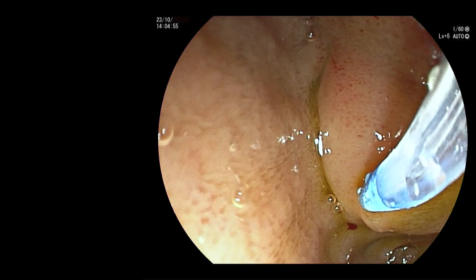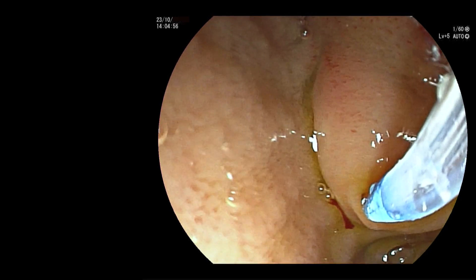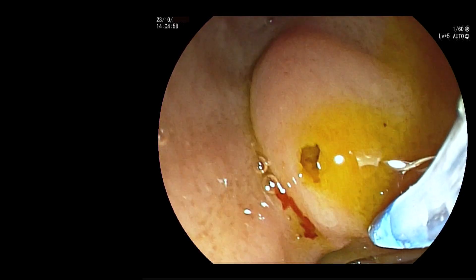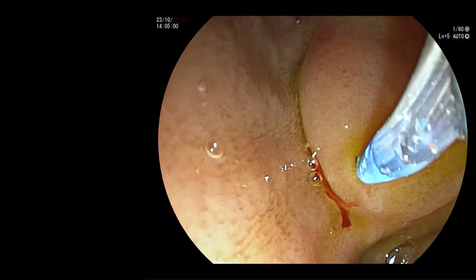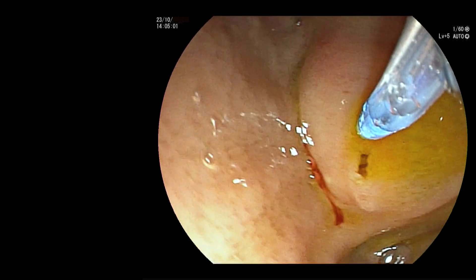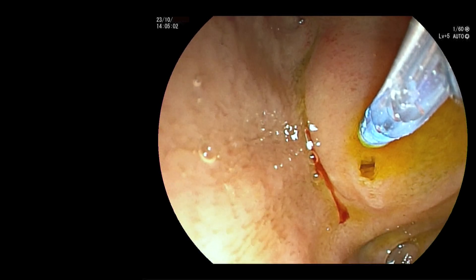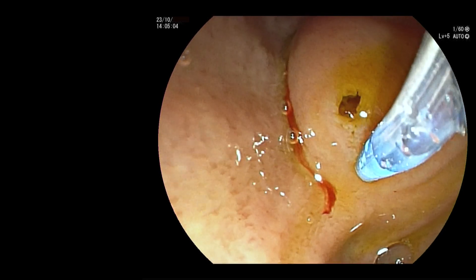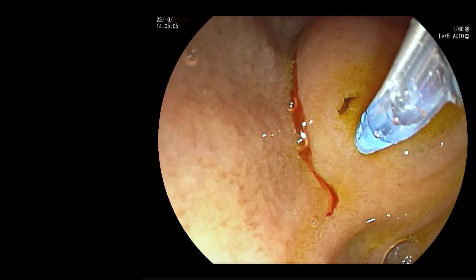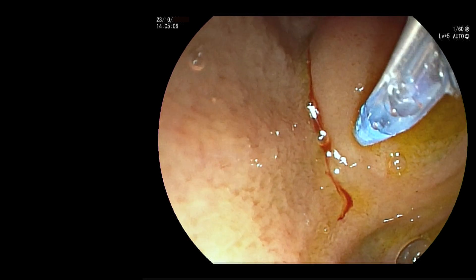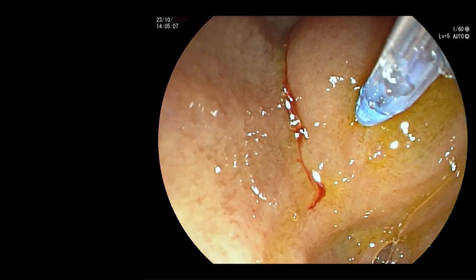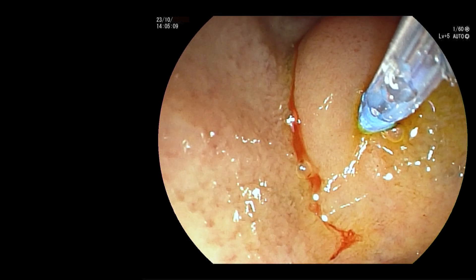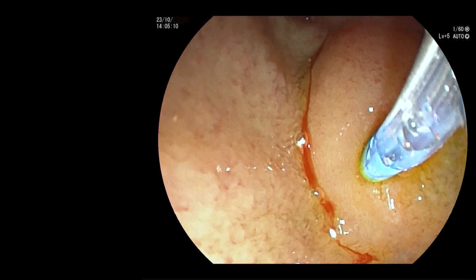The bile duct is cannulated using a wire-guided method.